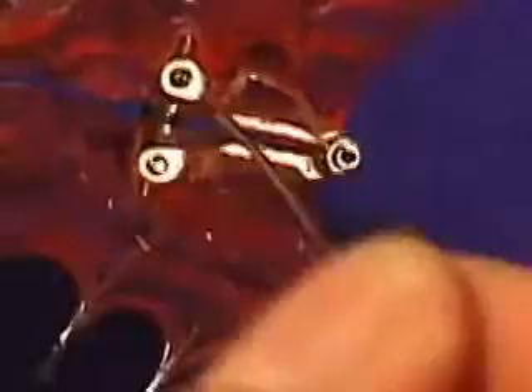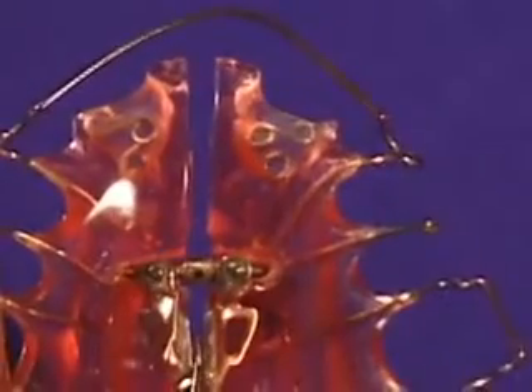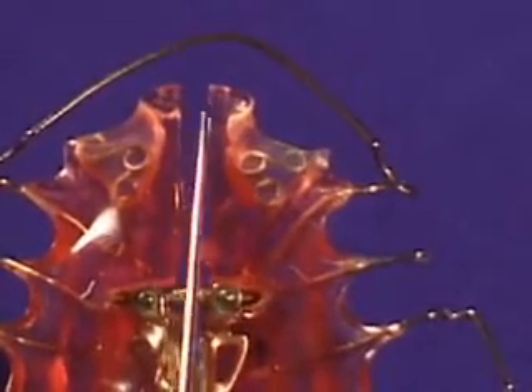One quarter turn equals one quarter millimeter expressed in the anterior portion of the screw. The suggested frequency of adjustment is one time weekly. This will allow for cuspid and bicuspid expansion with very limited posterior expansion.